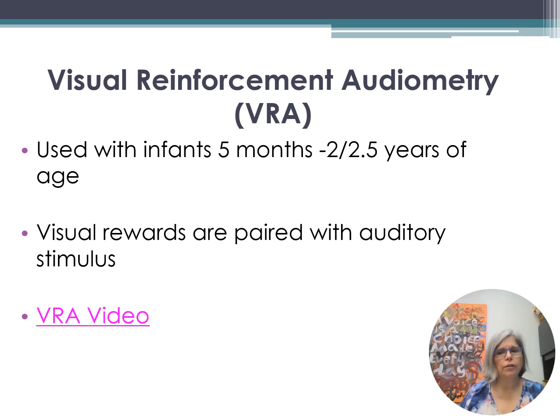This way the children don't have to learn to follow instructions. They're given visual rewards when there's an auditory stimulus. So when they respond to an auditory stimulus, they get movement, some kind of a visual response that they can attend to. I have a video attached here so you can see an example of that. This is used in small children, again, who cannot follow instructions accurately and don't understand the task. A behavioral response is used for this, a behavioral response to an outside stimulus specifically.